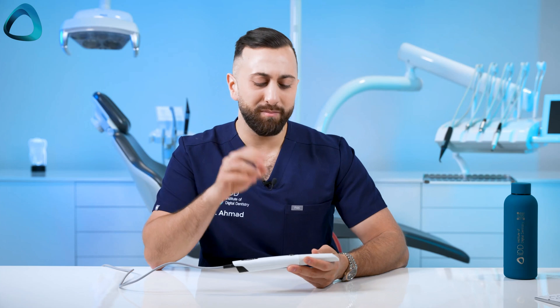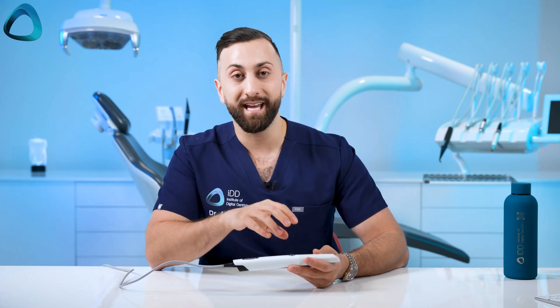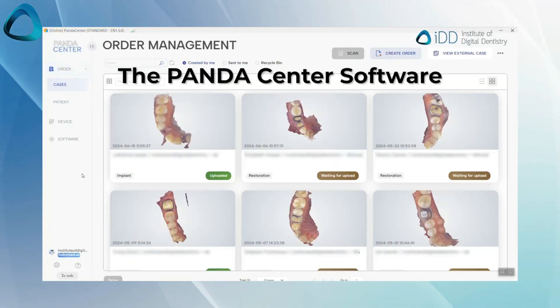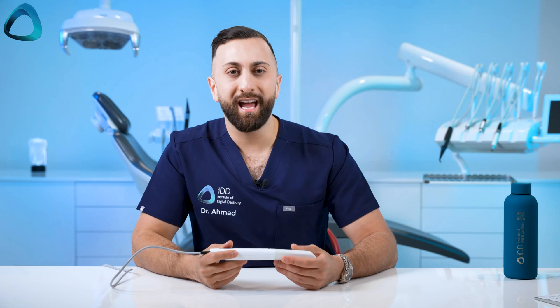One of the most interesting factors about the scanner is what the company is doing with their software. The intraoral scanner market is saturated, and while low cost is a main buying factor, software and workflows are what is differentiating scanners now. Their software is called Panda Center — their patient and scanner management software. Something popular with Chinese scanners is a user interface showing a preview thumbnail of all scans in the patient list, and you can find that here too.